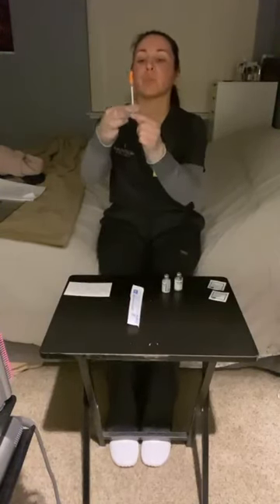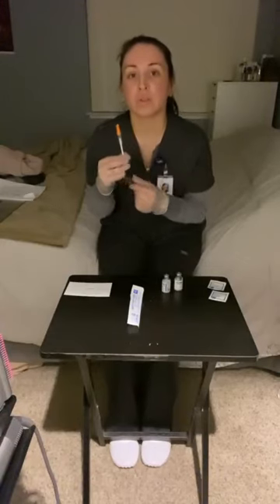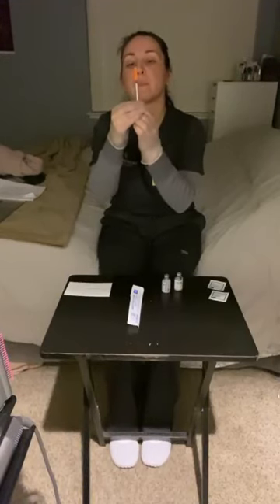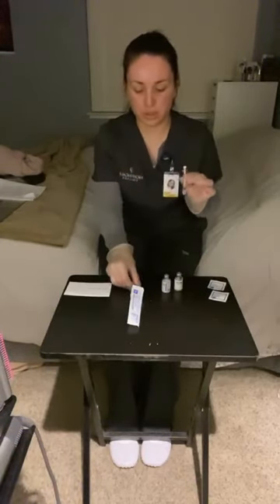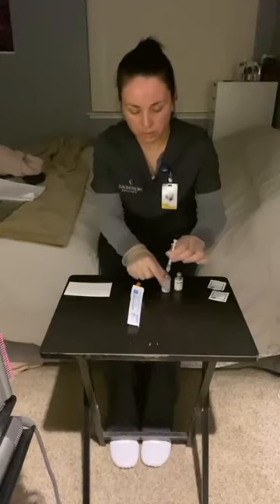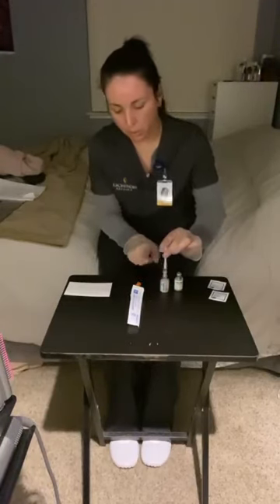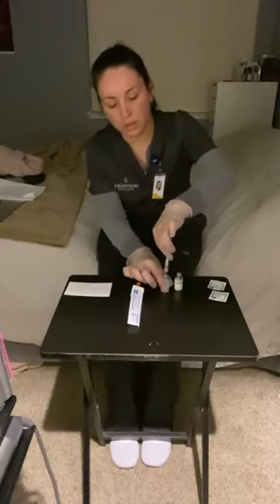I'm going to pull back on the plunger to get air to the intermediate amount of 8 units. I'm going to take the cap off and we're going to stick it into the intermediate vial, and we're going to inject the air without the needle touching the solution and aspirating any medicine. We're going to take the needle out.